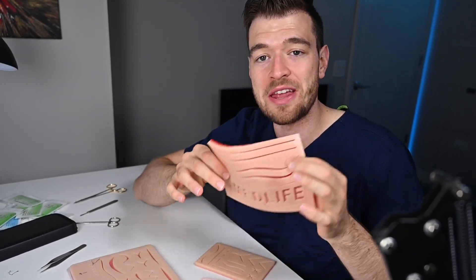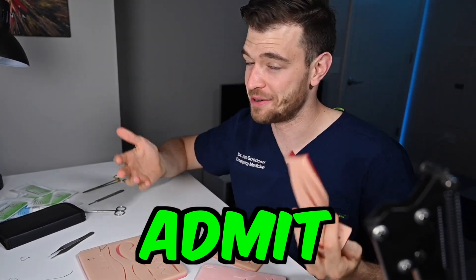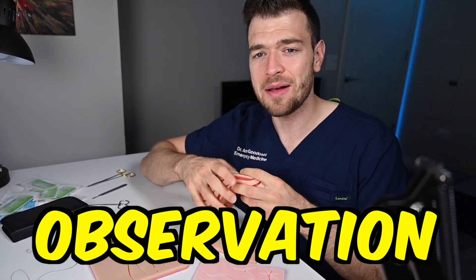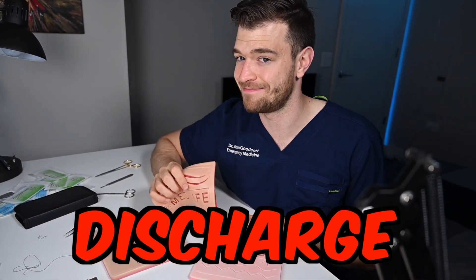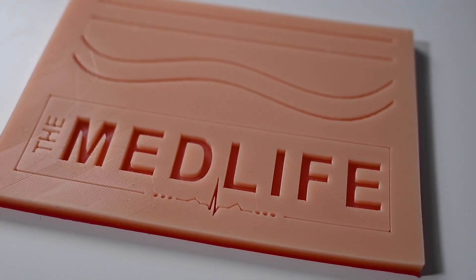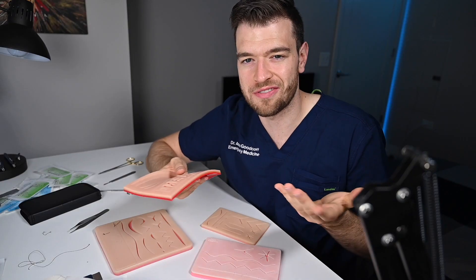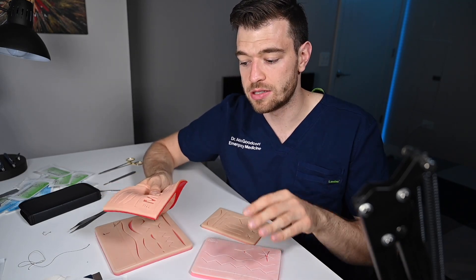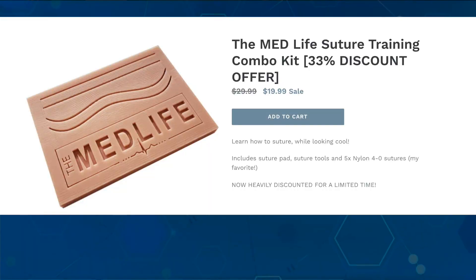If you're new here, things go on a scale of admit, observe, or discharge. Admit means go buy that or I really enjoyed it. OBS is so-so, middle thumbs up. Discharge is not for me. Overall, the MedLife pad — I think it's fine, it gets the job done. The tools are fine but not great, and the sutures are better than the sutures that came with others today. Overall, I give this an OBS.